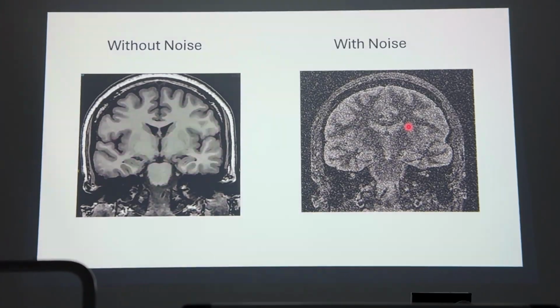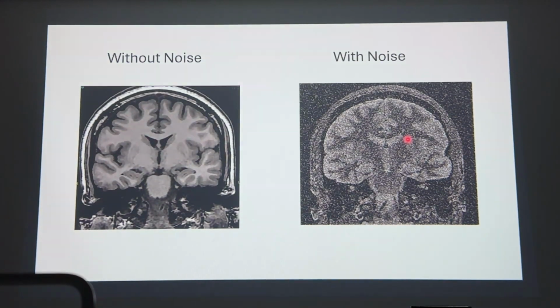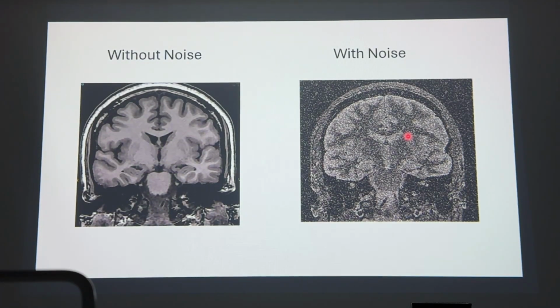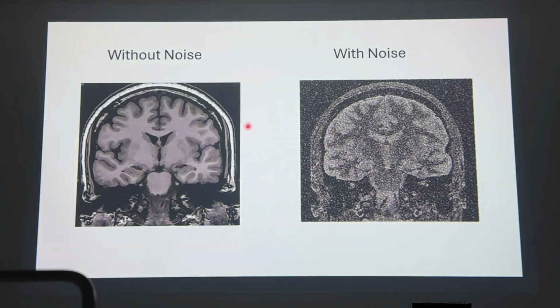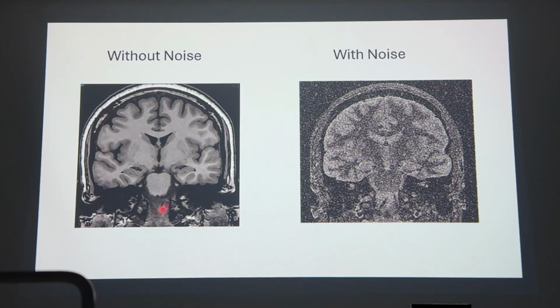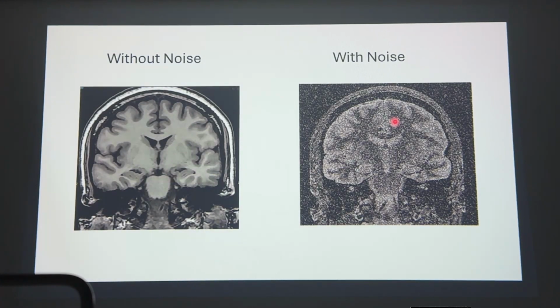And how do we quantitate the noise in the MRI image? This is by measuring the SNR, signal to noise ratio. And we have to say that increasing signal to noise ratio means improving image quality, and decreasing signal to noise ratio means decreasing image quality, as clearly shown in these two images. This is the perfect SNR. This is the low SNR, which reflects increasing noise compared to the signal.